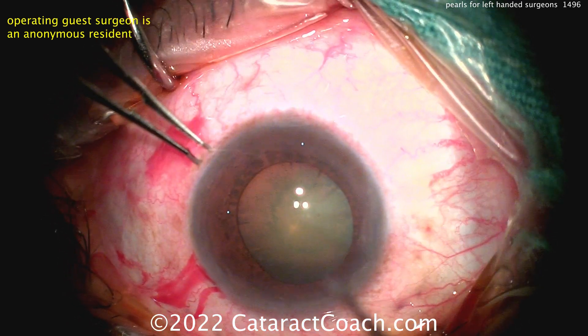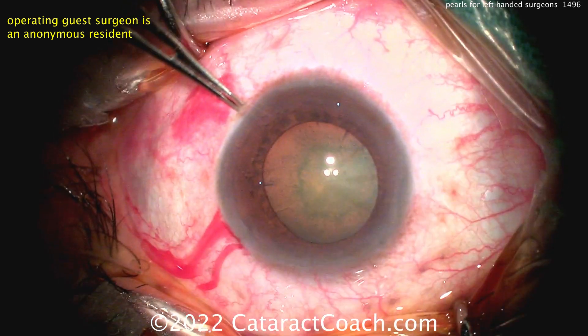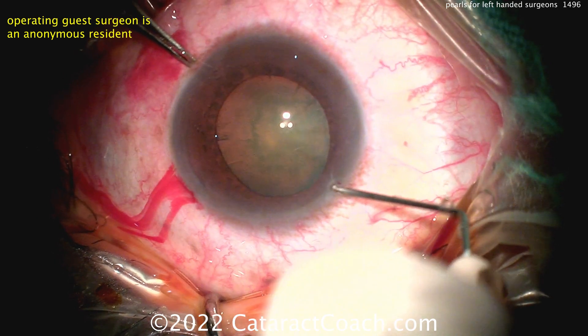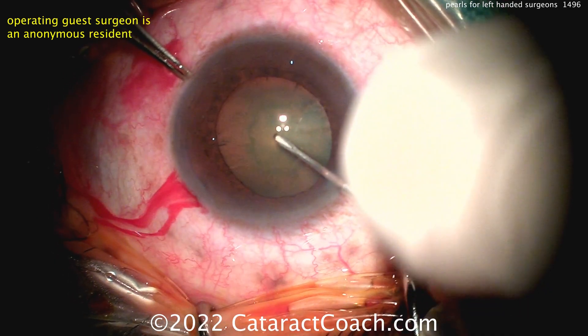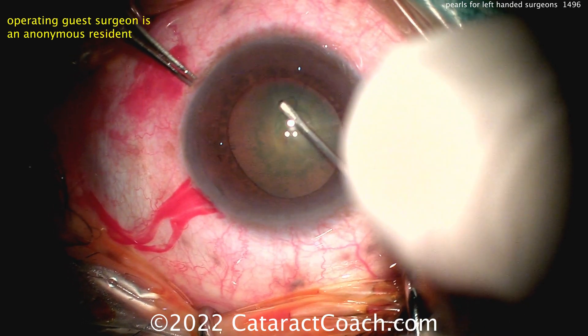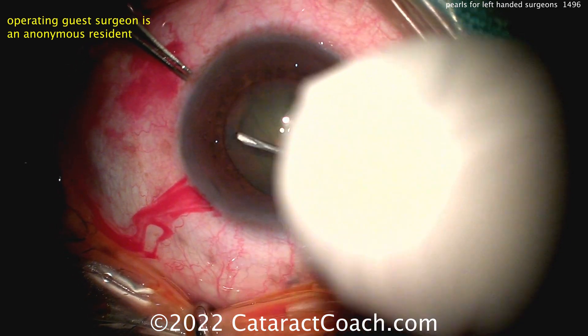When you do cataract surgery, think about it: which hand, for FACO chop, is doing most of the work and most of the movement? It's the hand that's holding the chopper. It's not the FACO probe hand, which is relatively stationary in the eye — it's the chopper hand.